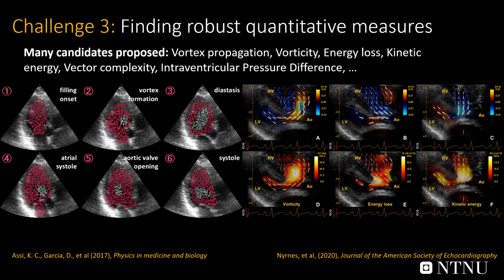The experience we do have from our different feasibility studies using blood speckle tracking for different groups of congenital heart disease is that one of the key challenges to making the quantitative analysis robust is standardization. Which leads us to challenge number 4.